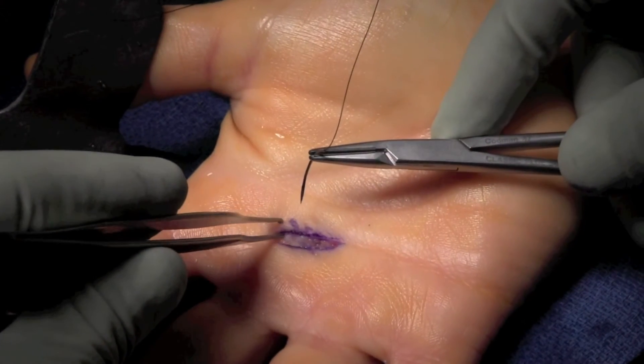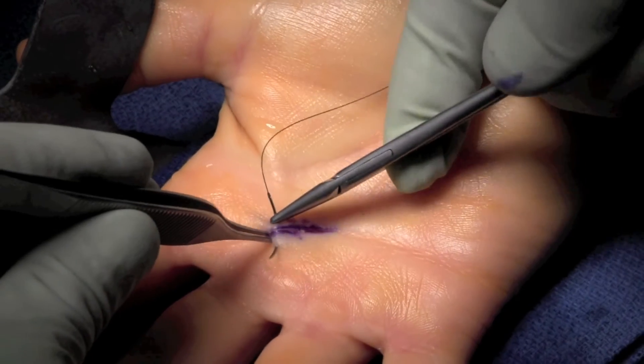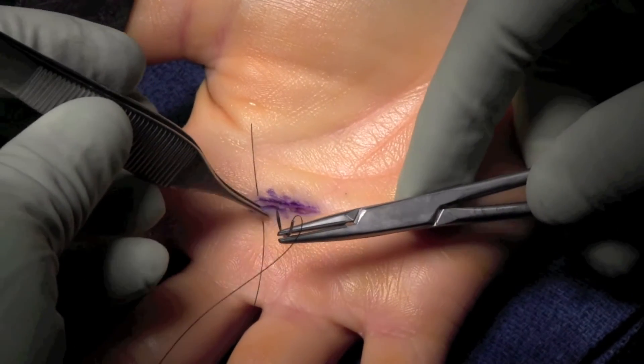The wound is irrigated. The skin is then sutured using a 3-0 nylon-type suture in a mattress-type fashion. Typically takes two to three sutures in this area.